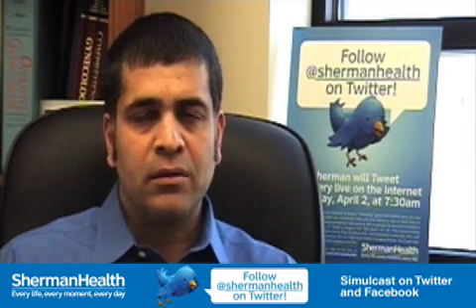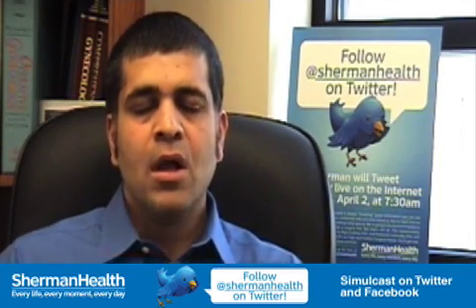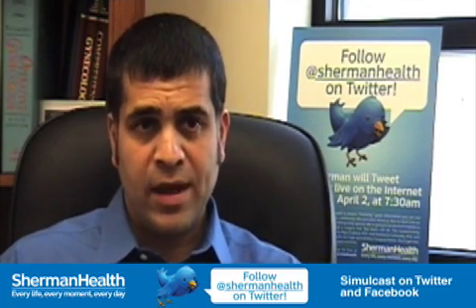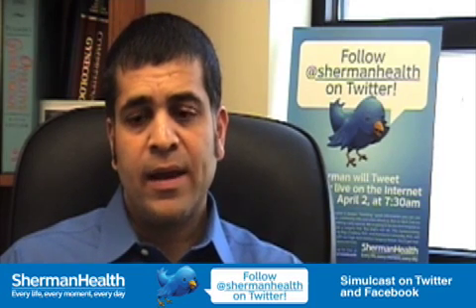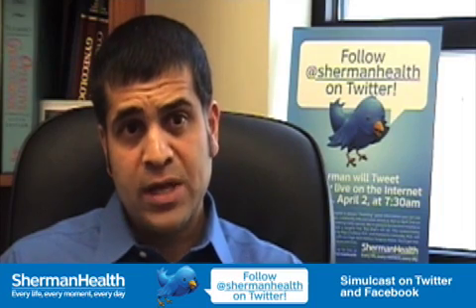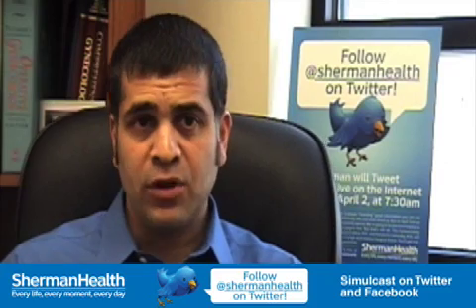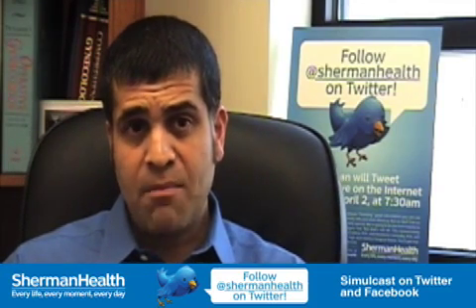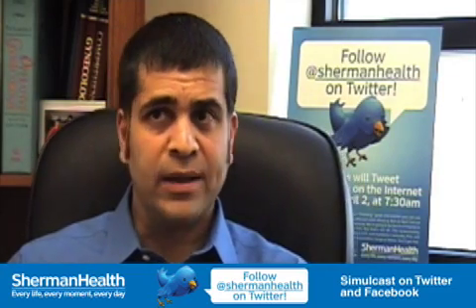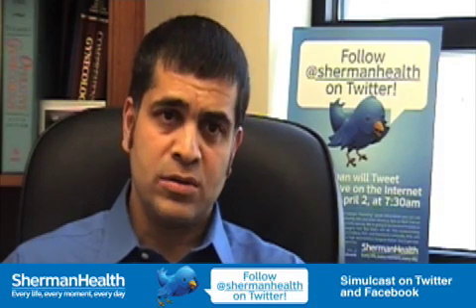Actually, there's three parts to the training. The first part is where you do a small course on the internet. You know, they have a website and you do that. Then the next part of it is where you go to Sunnyvale to their lab, and there you operate on pigs and you do the surgeries that we do on pigs. And then you come back, and after you've come back you observe at least two different doctors doing the surgery, and then you can do the surgeries.